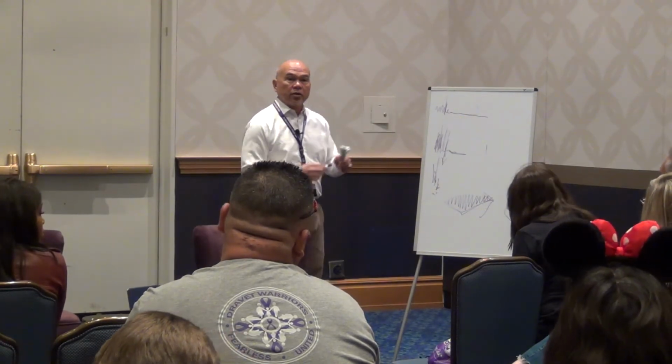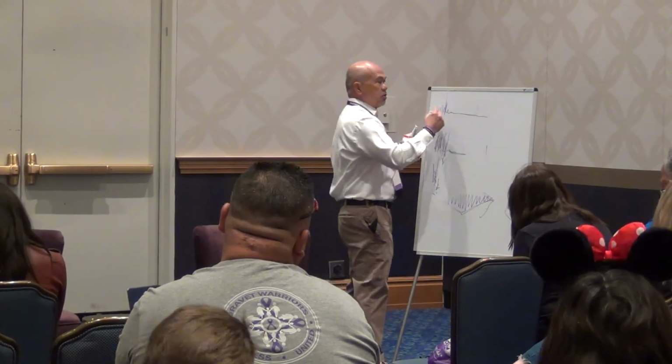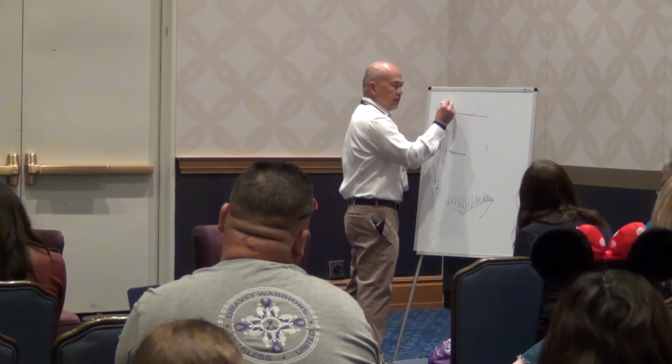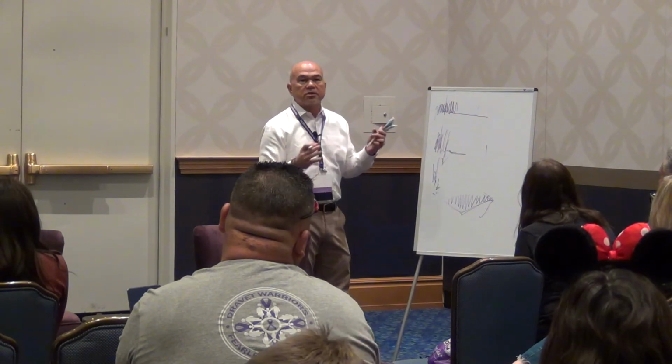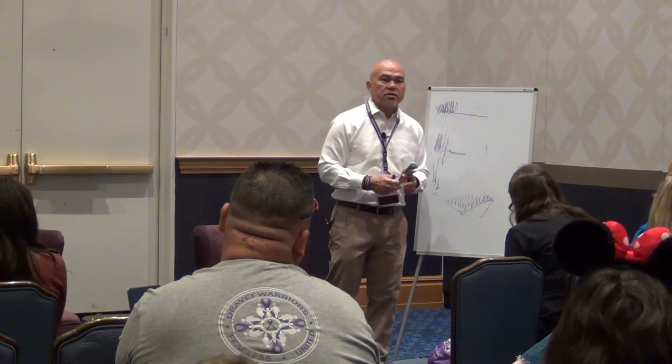So is it hard if they're moving? Yes. It's hard when you're moving because your EEG could look like this. We could do filters and try to minimize the movement, but it's not going to be good. Sometimes I read an EEG that looks normal, but the quality is so poor because of the movement. So if you're thinking of seizure, you need to bring this kid back and maybe sedate the kid so they don't move as much, so you get a good quality EEG.